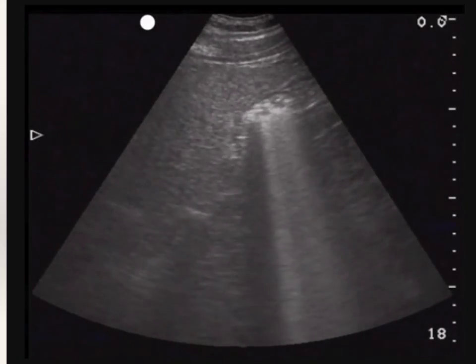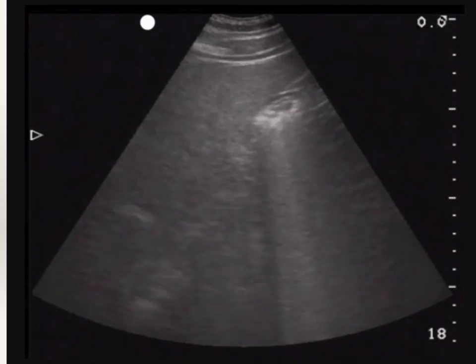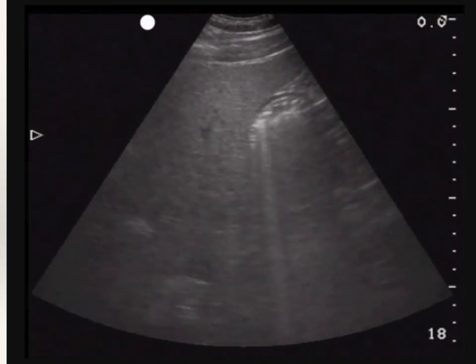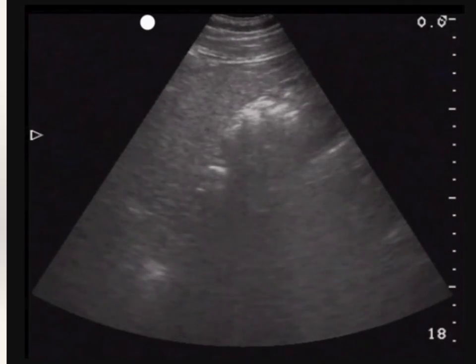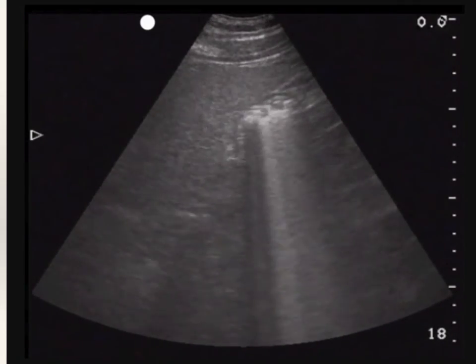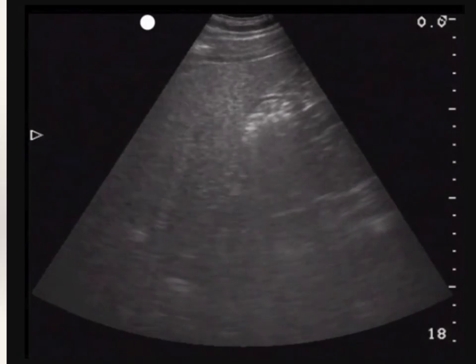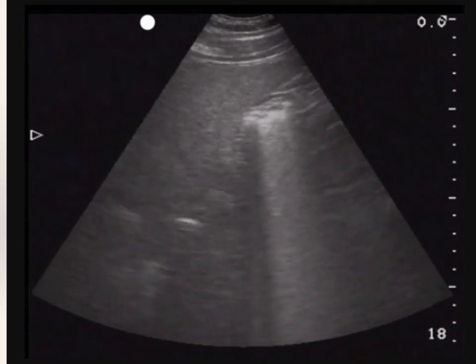Now, while we talked about the highly suggestive feature of the clean shadows versus the dirty shadows, there are also some anatomic indicators that don't rely on the pattern inside the lumen. Firstly, the gallbladder should be traced to the MLF and then the portal triad. Secondly, the duodenum can be followed back to the stomach. And thirdly, the outer wall of the gallbladder will be hyperechoic, while the outermost muscular layer of the duodenum will be hypoechoic, like in this case.